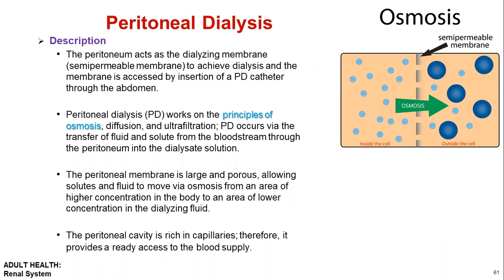Peritoneal dialysis is the instillation and dwelling of hypertonic dialysate solution in the peritoneal cavity to remove the waste product, and it is the alternative to hemodialysis for older adults or those with intolerance of anticoagulant or vascular access difficulties.